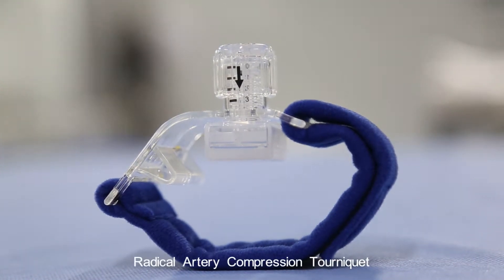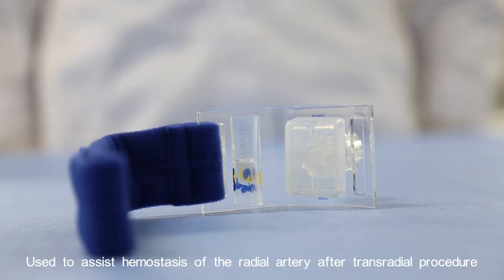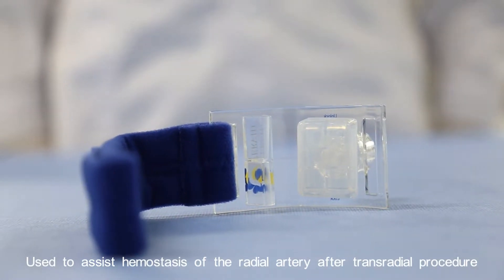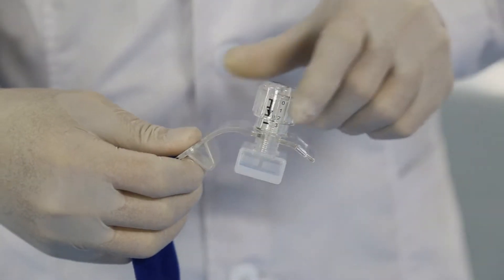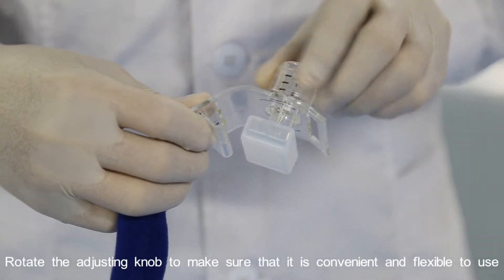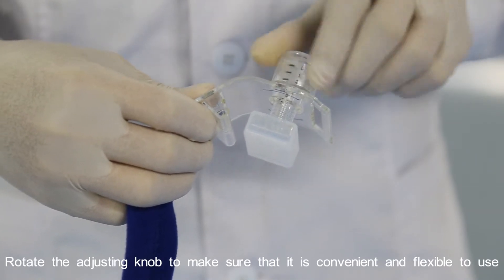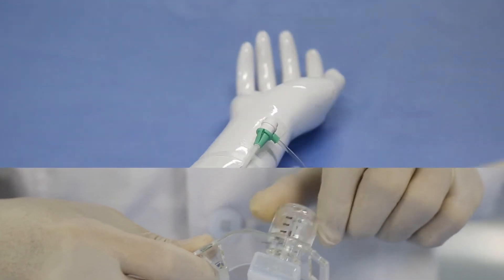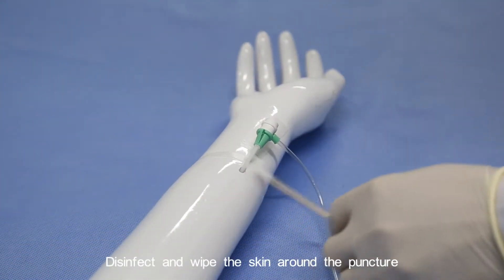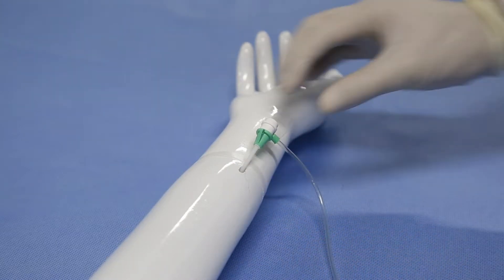The radial artery compression tourniquet is used to assist hemostasis of the radial artery after a trans-radial procedure. Rotate the adjusting knob to make sure that it is convenient and flexible to use. Disinfect and wipe the skin around the puncture site.